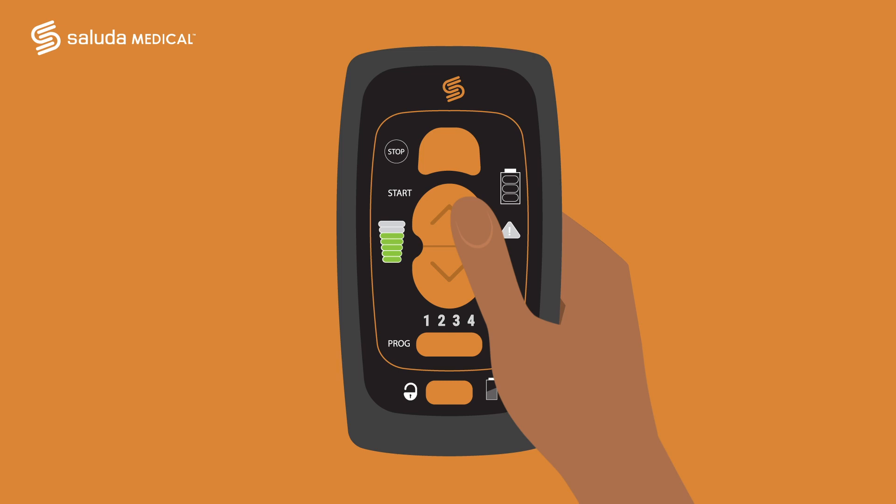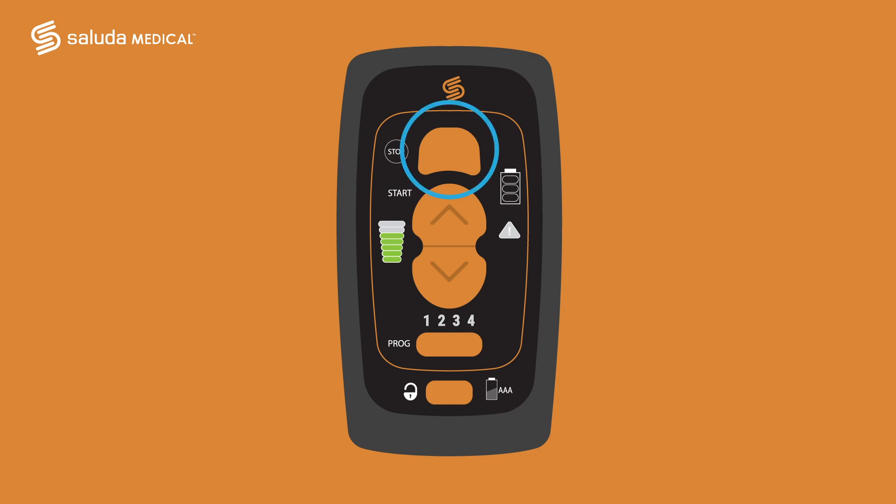If you need to stop your stimulation, go to the top middle — the large orange button next to the stop symbol — and press the button. For the stop button to work, you must first turn on your remote.